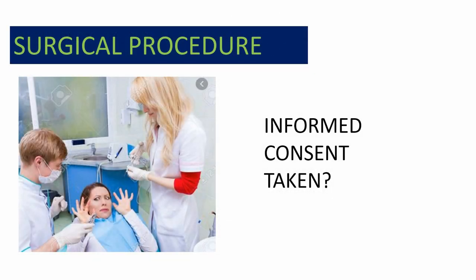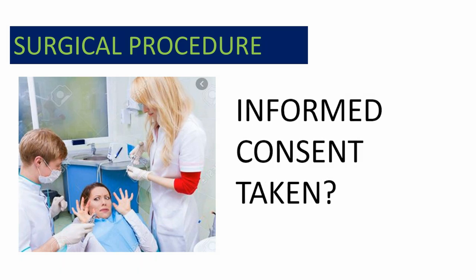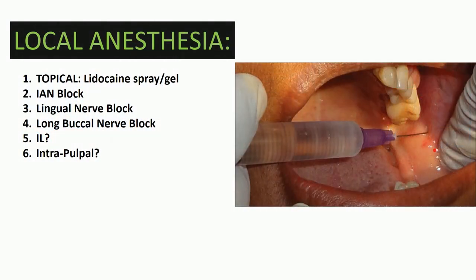The patient is prepared mentally and informed consent is taken. The patient is asked to do a mouthwash with an antiseptic like betadine. The chair, light, suction, and other instruments should be ready and sterility should be maintained throughout the procedure. Assistance at the chairside is also needed. Removal of wisdom teeth is done with local anesthesia.